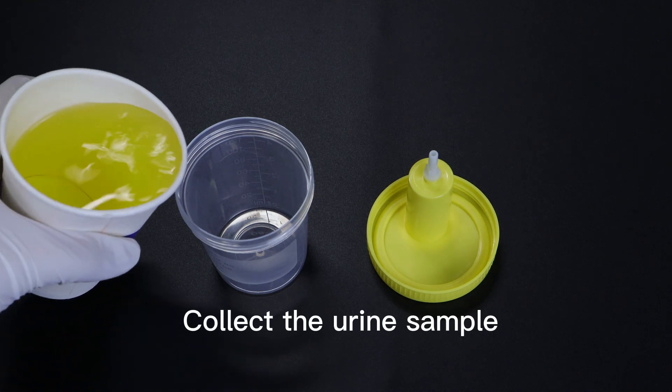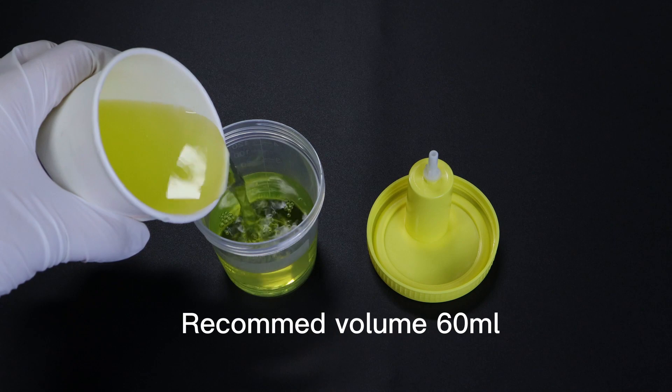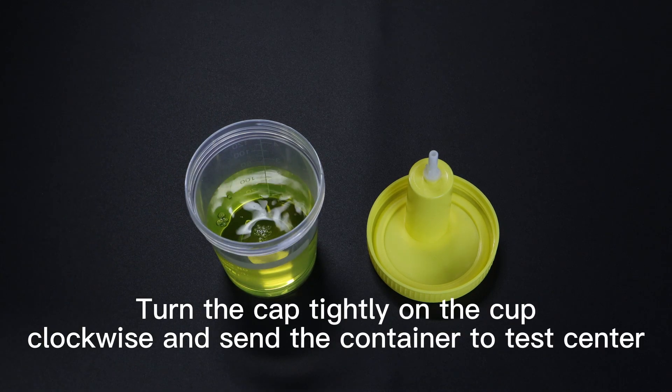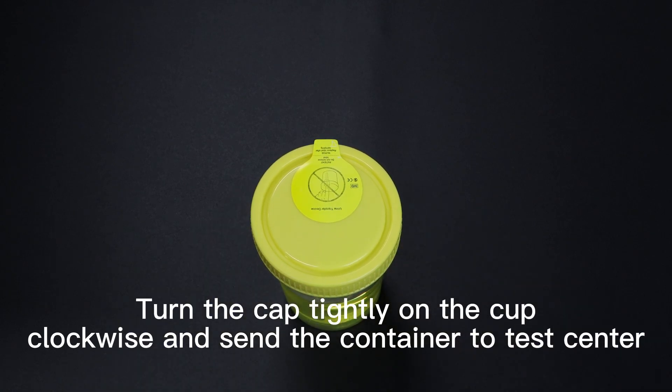Collect the urine sample. Recommended volume is 60 ml. Turn the cap tightly on the cup clockwise and send the container to the test center.